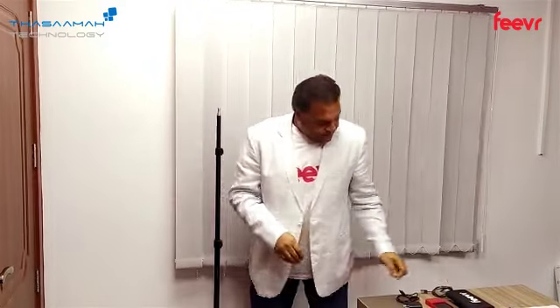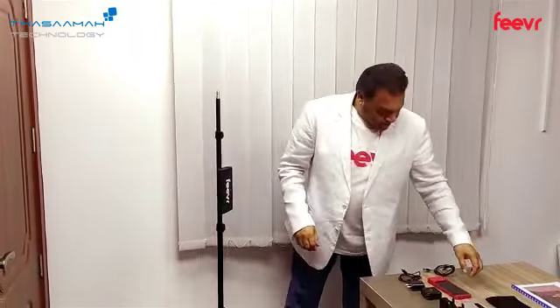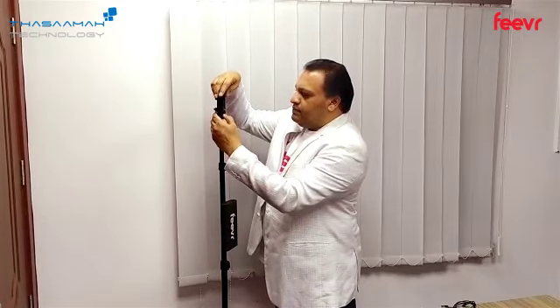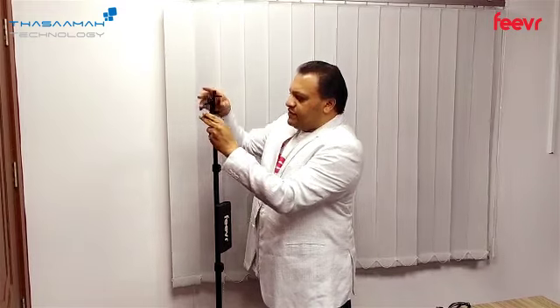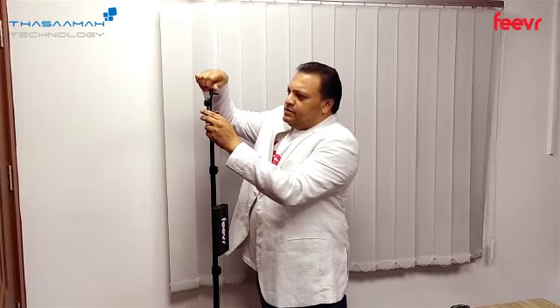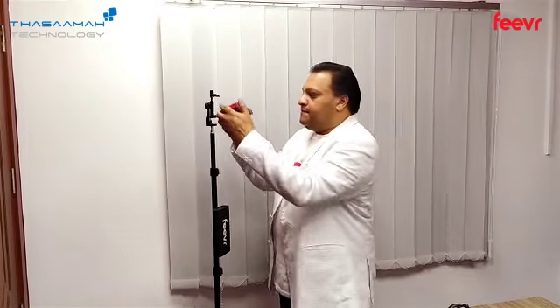As you can see, this is the power bank. I'm connecting the power bank. The clamp to hold the mobile. Perfect. This is to adjust the holder. Keep the device.